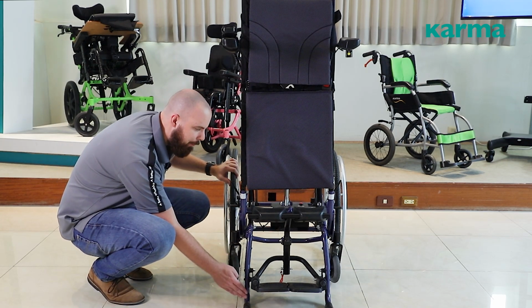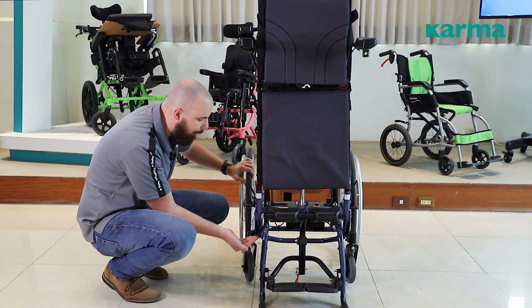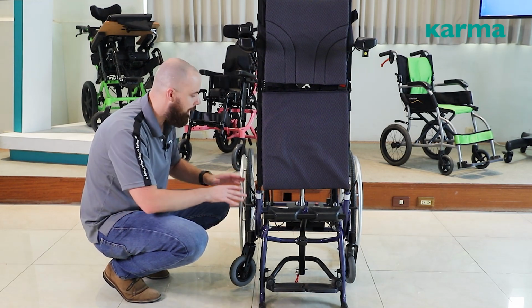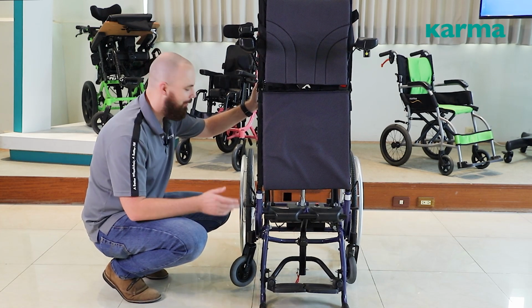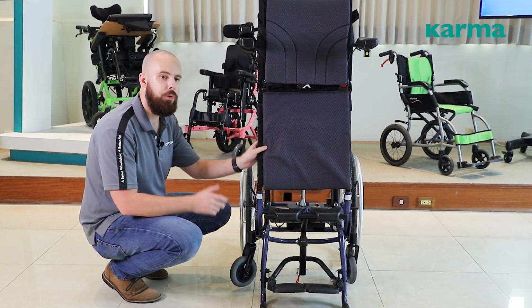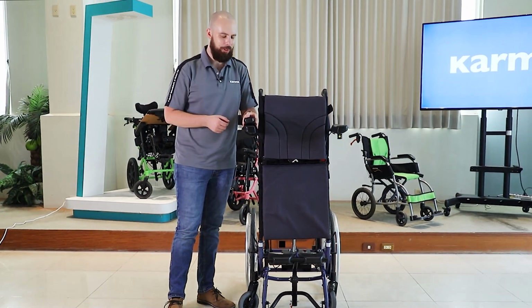Additionally, we have these support bars on here. I'm not sure if you noticed, but when we were standing up, these actually move down and touch the ground and lift the entire chair up. So you'll see now the caster is free floating. Now, the purpose of this is that we increase the wheelbase. So it creates a lot more of a stable support system for this chair. So you're not going to go anywhere when the chair is up. Now that means you also cannot self-propel the chair. You are in one position, but this is for the safest position. All right, so now we'll come back down. Just press the down button on the controller.